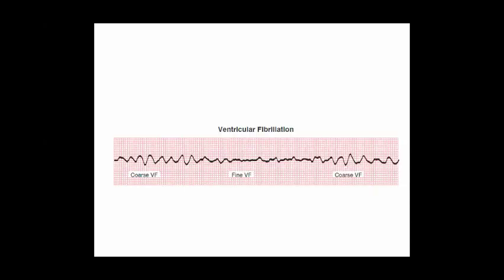And here we come to ventricular fibrillation. Ventricular fibrillation is a very, very important entity to know, because the life of the patient depends on early recognition of this rhythm. With this rhythm, the patient needs immediate defibrillation and cardiopulmonary resuscitation, CPR. So detection of this rhythm is very important, because this is an arrest rhythm. The patient has no electrical activity and no circulation now. So the patient needs to be defibrillated as soon as possible, either by an external or automated defibrillator, or by using our conventional DC units in cath labs or in our CCUs.